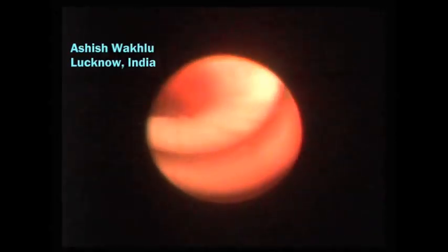Here we can see the bronchoscopic view, which shows a continuation in the left main bronchus. However, the right bronchus is seen to end blindly about 1.5 centimeters below the carina. It may be possible that the discontinuity of the right bronchus was due to some kind of inflammatory process or stricture formation after birth, as embryological absence of the right bronchus would conceivably lead to failure of development of the right lung.